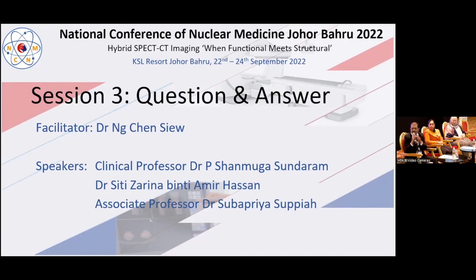You are doing a pertechnetate scan to start with. When you are doing a pertechnetate scan, you have a pertechnetate uptake in the thyroid. Even though we are doing the study at the 20th minute after the injection, the uptake of technetium, even though it is not organified but just trapped, will reduce, but still the background will be significantly high. The thyroid uptake will always be there. So I personally feel the delayed retention of the uptake, especially in the upper or lower pole, or if there is an ectopic in the mid pole of the thyroid, you are missing it out.